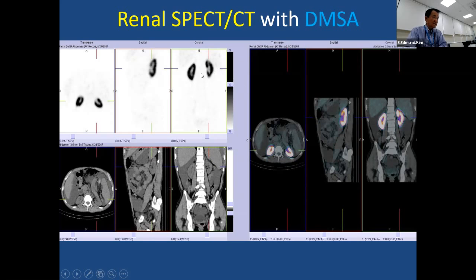If there's any scarring or some hump, we call it a physiologic hump, then they raise a question about some kind of tumor on CT, MR, ultrasound. This agent will delineate the margin very clearly, particularly using SPECT CT. We can solve that kind of question by correlating with the CT.